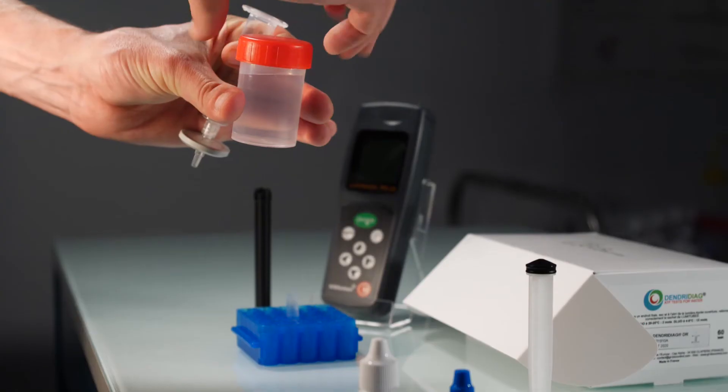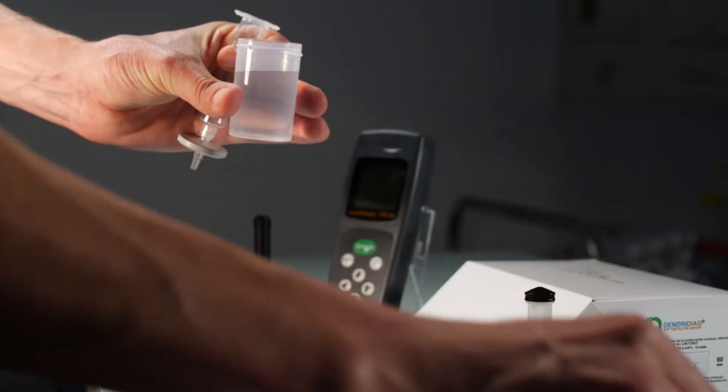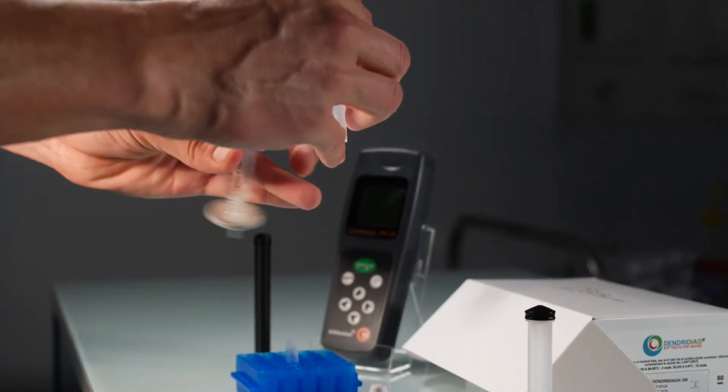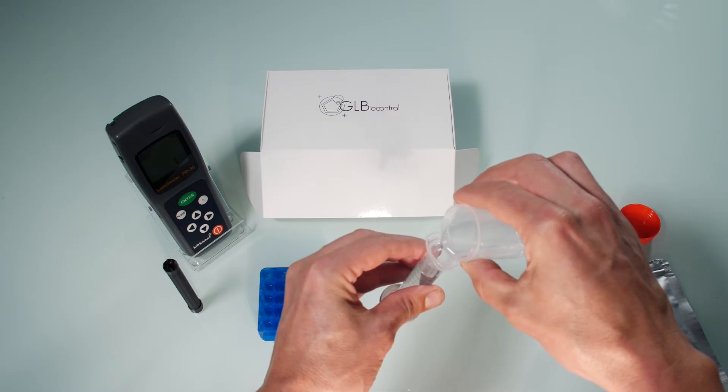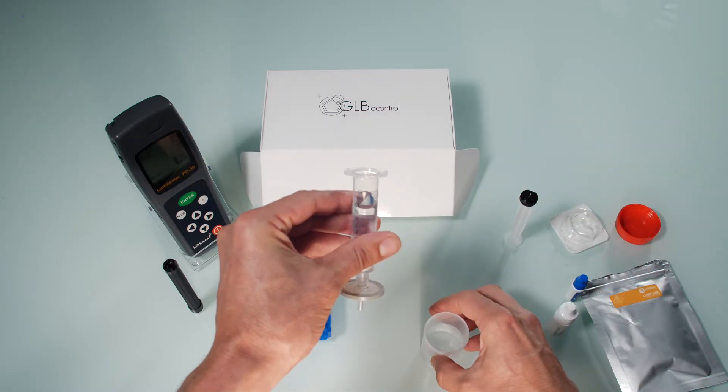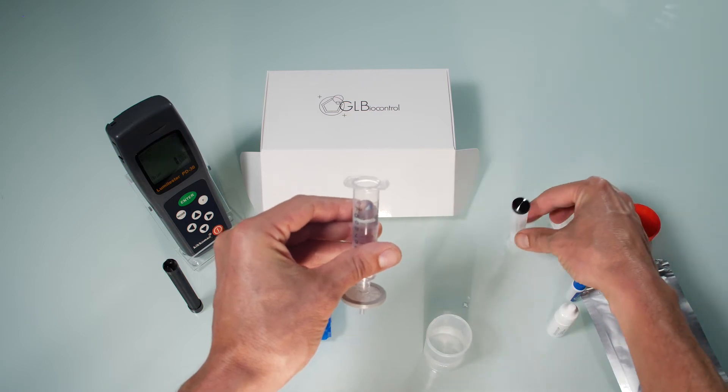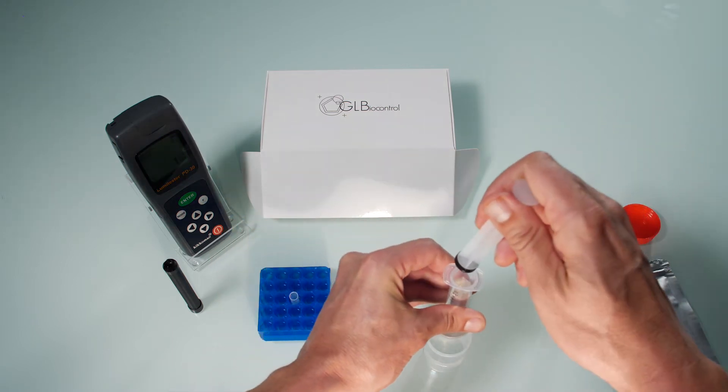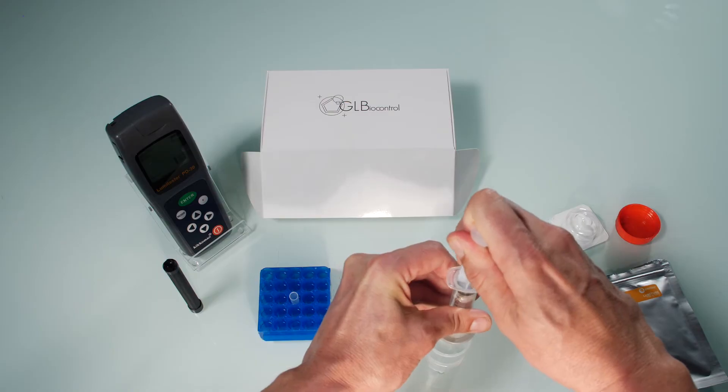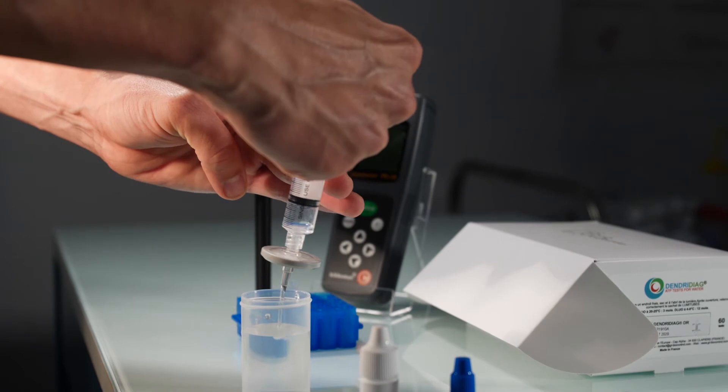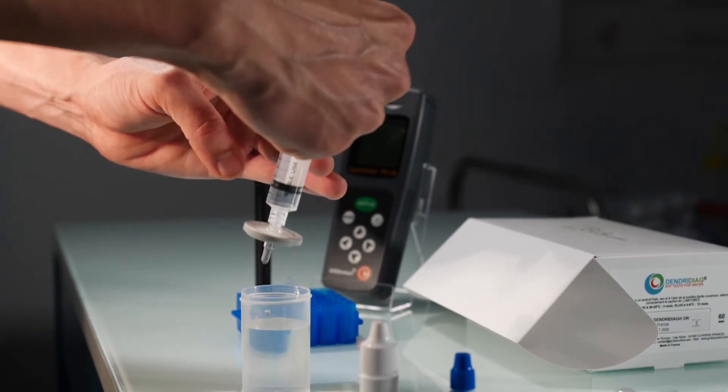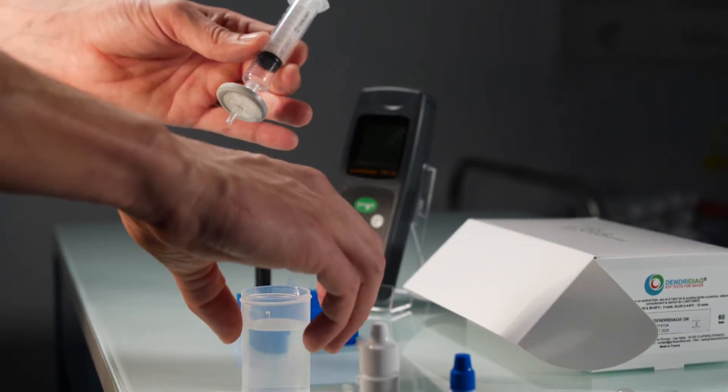Take the sample container and pour 10 milliliters into the syringe. Use the marks on the syringe to note down the exact volume. In this example 10 milliliters. Filtrate all the water sample. Be very careful not to dry the membrane by pushing to the end of the barrel. Filtration concentrates the microorganisms on the filter and removes free ATP.